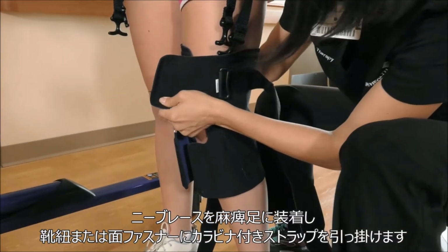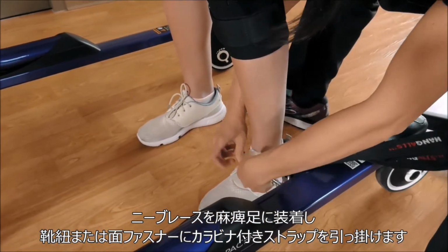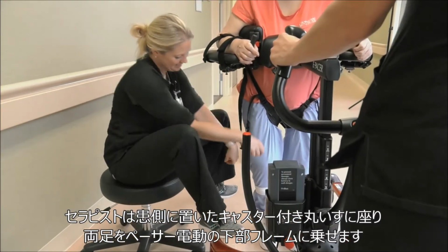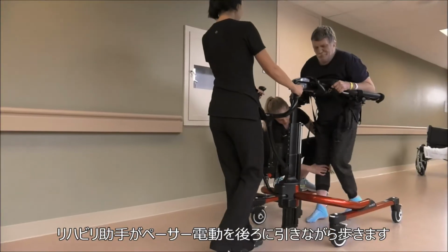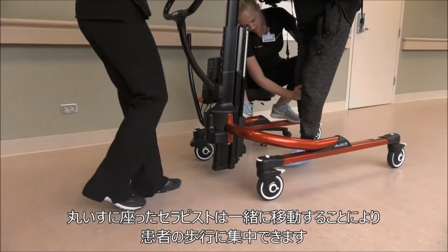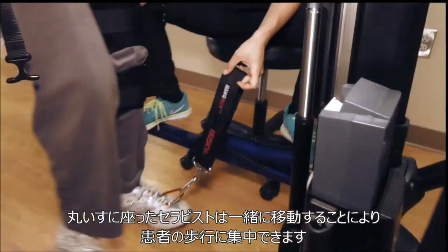Apply the knee brace on the affected side. Clip the carabiner of the Husky hang-all to the patient's shoelaces on the affected side. The therapist sits on a rolling stool on the patient's affected side and puts her feet up onto the side of the e-Pacer. An assistant should advance the e-Pacer by walking backwards. The assistant pulls the e-Pacer and the therapist along. This allows the therapist to focus on facilitation.